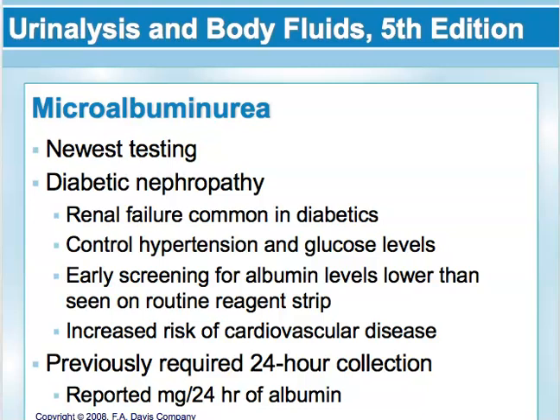Microalbuminuria strips. So this is new testing. Previously I mentioned that they have reagent strips that test for multiple parameters, and then some that are just single tests. So the microalbuminuria strips were developed to identify patients at risk for diabetic nephropathy or cardiovascular disease. It should be done on a first morning specimen, and then there are several different strips in use now from different manufacturers. All of them use different methodologies.